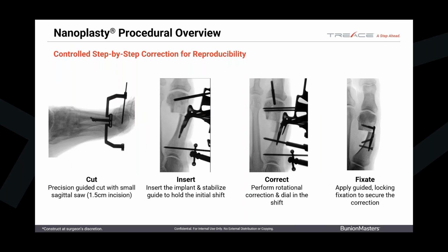So once you insert the plate into position, you will then secure the plate to the metatarsal, and then secure the jig to the metatarsal, and then do your translation. Once your translation is corrected to where you want it, the exact percentage, be careful about over translating because you can bust that medial cortex of the first metatarsal.